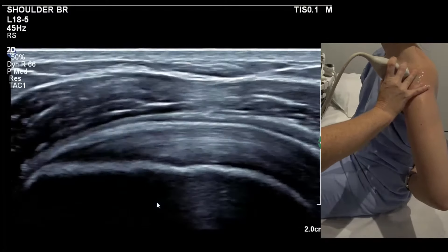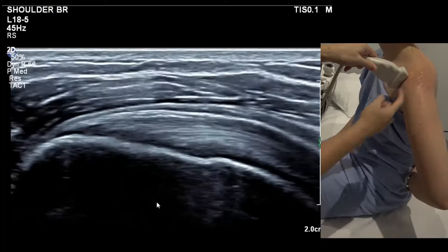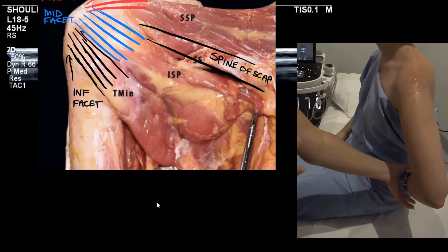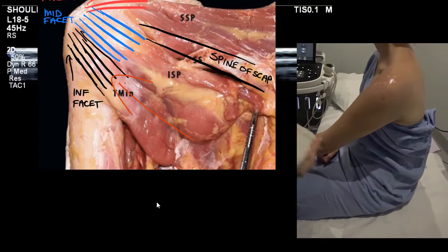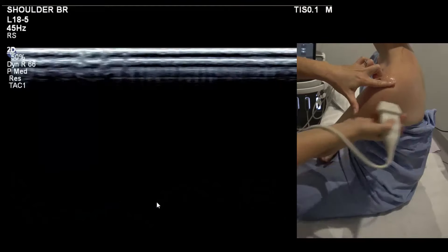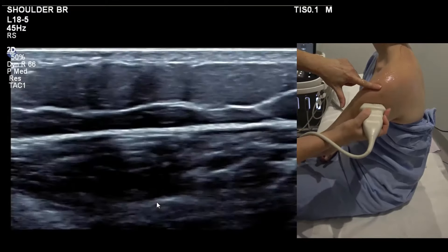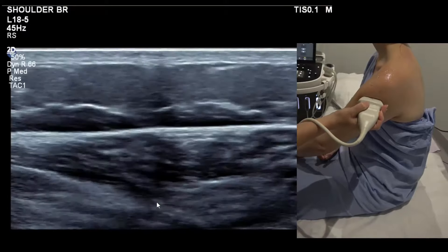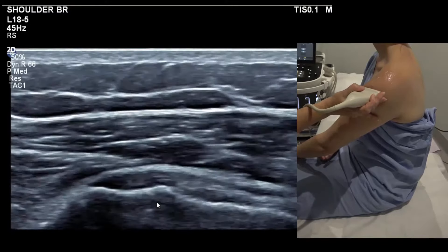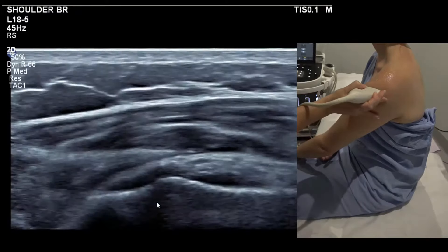The final tendon we do is teres minor. Transitioning from infraspinatus, just move distal down the arm and you see a tendon that's half the thickness — that's teres. The easiest way to image teres if you're starting out is to have the patient hold the opposite thigh. Take the spine of the scapula as your probe orientation, plonk down about three to four fingers below the shoulder tip, and run up the back of the humerus until you hit the first tendon — that's teres. Make it nice and flat.